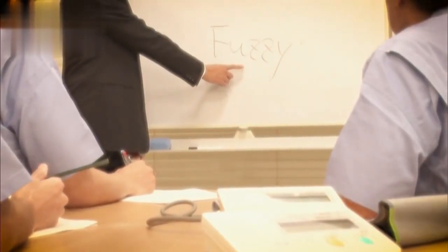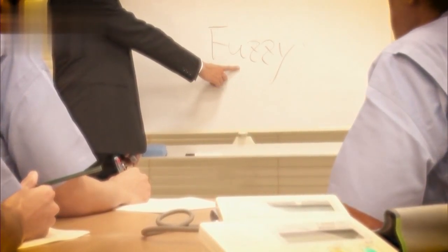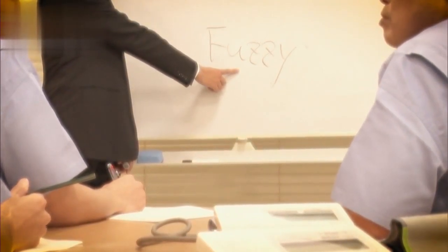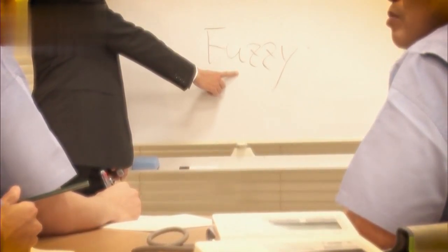A member of the fuzzy logic team explained that it was something an American scholar proposed in the 60s. By using fuzzy logic, a machine could act somewhat like a human does. The developers listened with great interest. To put it simply, if you control something using fuzzy logic, you can reproduce in a machine something akin to what a human would do based on experience or their senses. It looked like a good fit for controlling the pressure of the cuff.